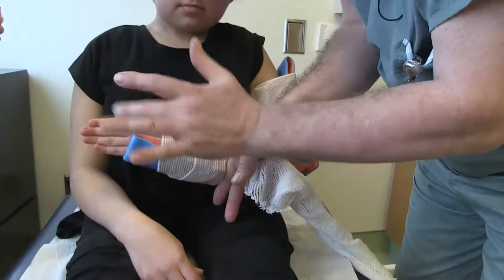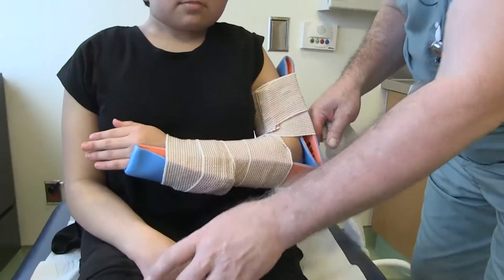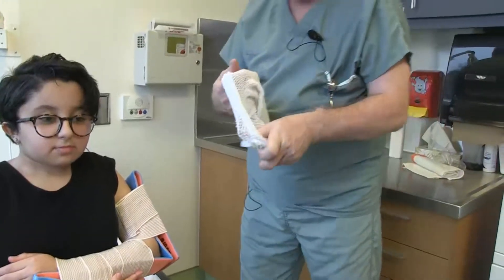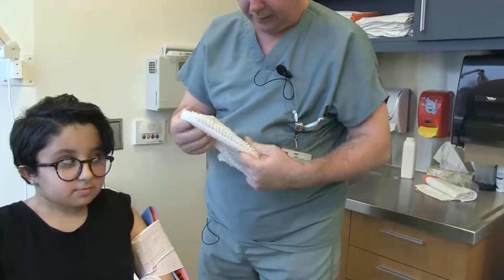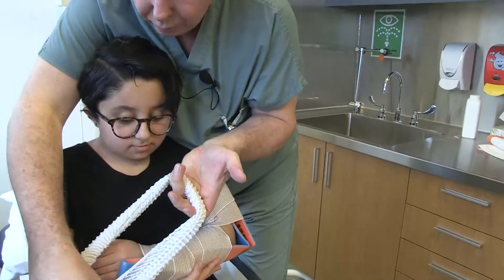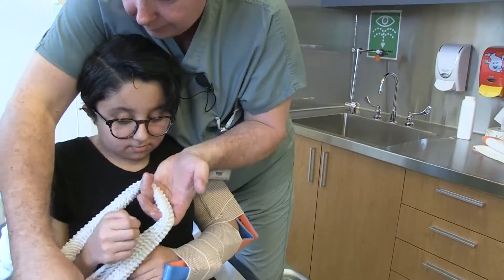Kenza, are you able to move your fingers? Can you hold your arm while I put on the mesh? So we take our mesh. I have to don it on your right arm like so.